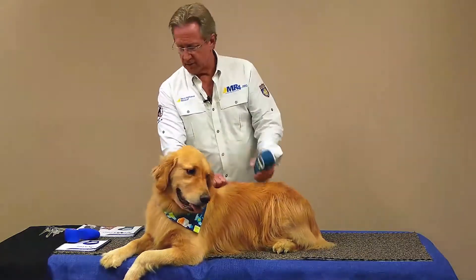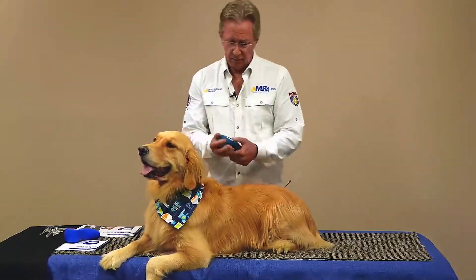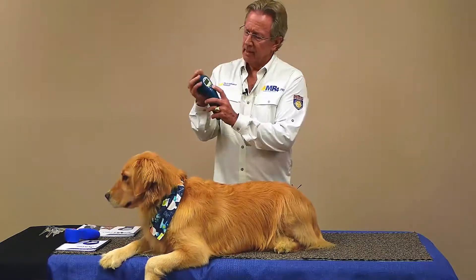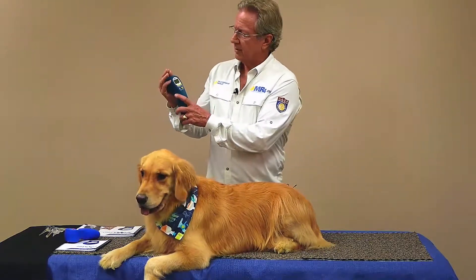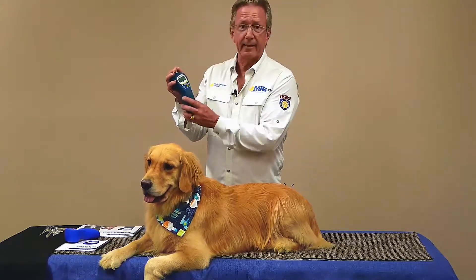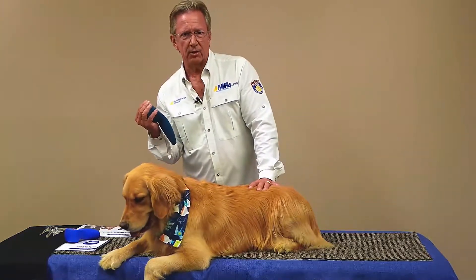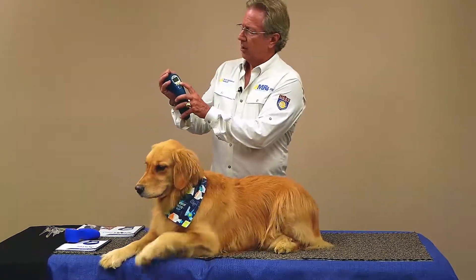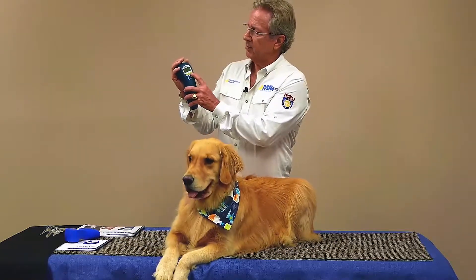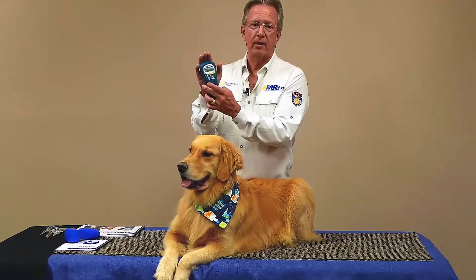The Activet Pro — this is going to be a quick start guide for you as a veterinarian to get started with us. Just have your hand over the front, hold the power button down until it comes on. It will ask you if you want to go through a self-test — we'll say no. It's already set to Activet Pro, we'll select that, and for this purpose we're going to show you the unwind protocol. 1000 Hertz is your go-to for pain, so we just scroll right over to 1000 Hertz, press select, then select our time. We'll scroll over to five minutes and just push the power button — you've now started.